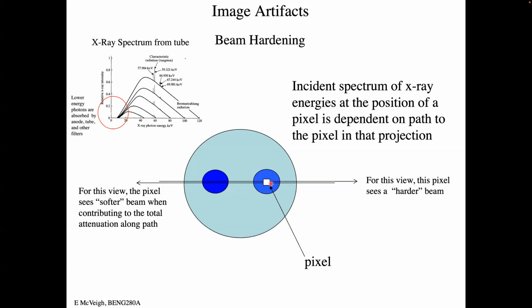Sort of, but you know, average in what sense? Because each projection is like a unique data set that is combined with back projection, right? And so the fact that you have a projection at 180 degrees, which should explicitly be a mirror image of the projection from the other 180, turns out it is not, right? And so you could say, well, if I just back project this and back project that, I would just get the average, right? But then there are inconsistencies in what it gets from every angle, right?